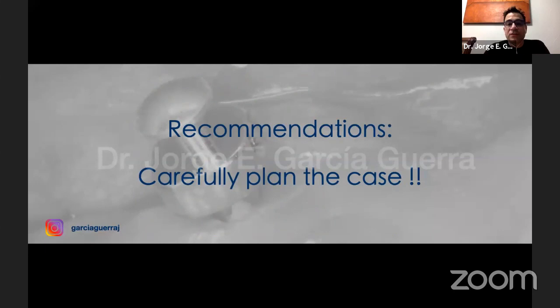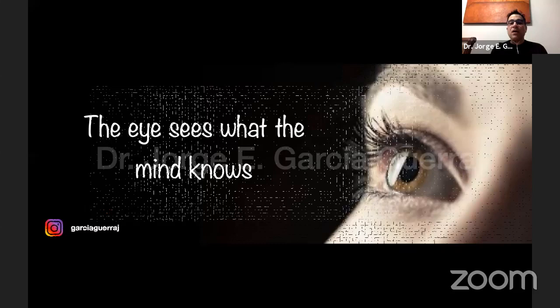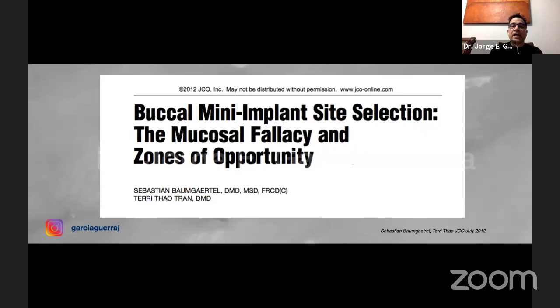Now, the recommendation is to carefully plan the case, so you can choose the best implant, the best size of implant, and the best insertion site. We must remember that the eye sees what the mind knows. When we don't know what we're going to do, it's easier to overlook certain details, but when we understand correctly what we're going to do, it's easier to see the different situations that we need to work with, okay? Now, I recommend this article. It's about the zones of opportunity, for implant site selection.